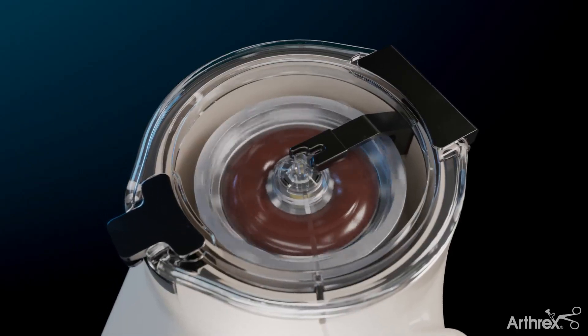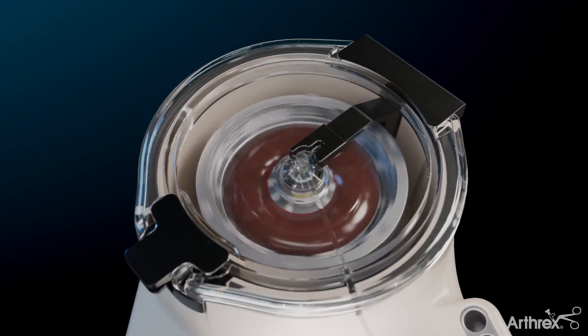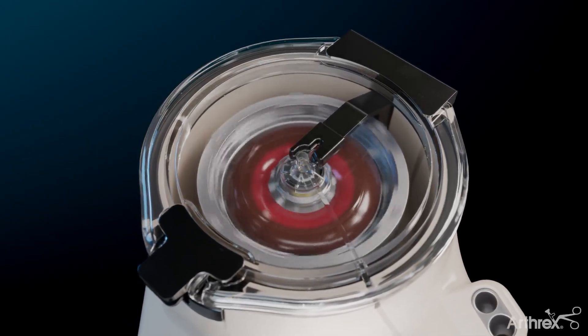The ANGEL system uses proprietary three-sensor technology to develop a customized, patient-specific formulation of CPRP from BMA.